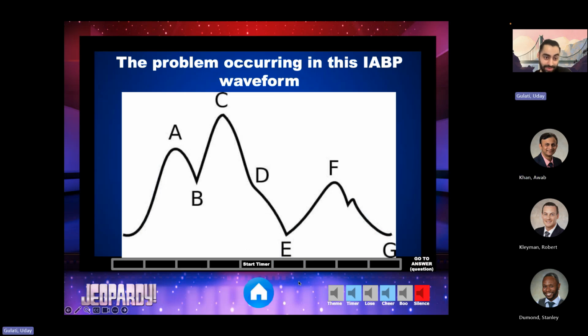All right, what's happening in this balloon pump waveform? You've kind of narrowed it down to four choices. You said in the last question that an issue could be delayed inflation. If you break it down, there can really be four issues with the balloon pump, especially in regards to timing. It could inflate too early, inflate too late, deflate too early, or deflate too late.